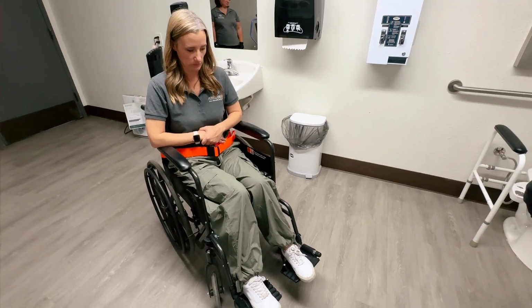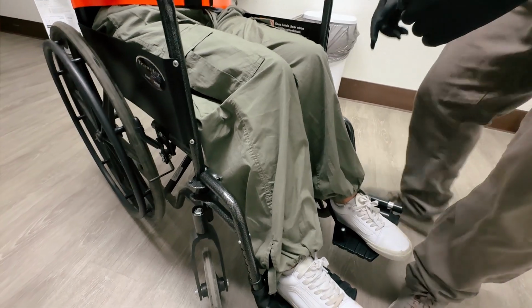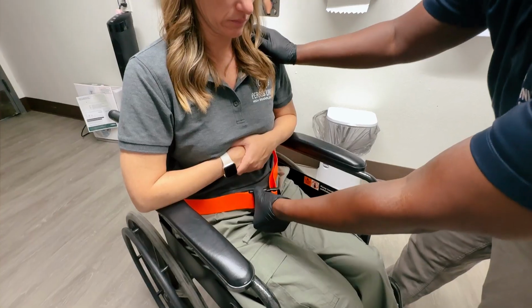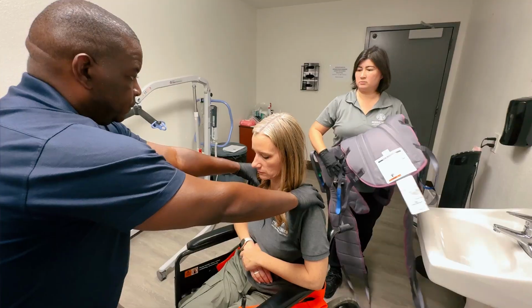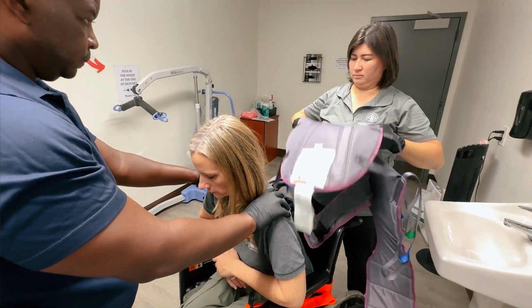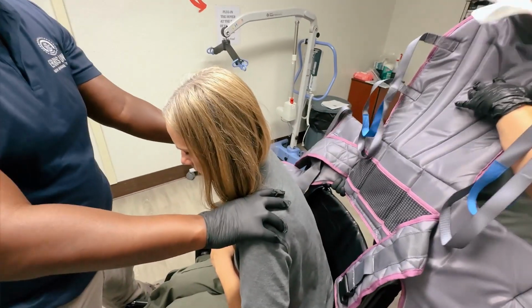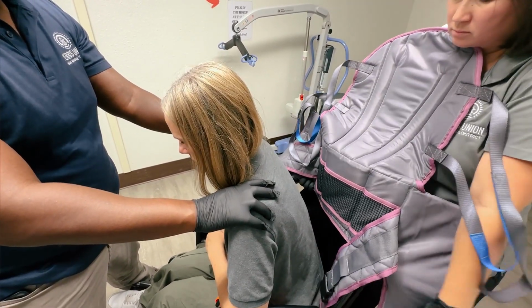Lock all wheels on the wheelchair to prevent the wheelchair from moving forward or backward. Making sure at least one assistant is supporting the student, remove the wheelchair seatbelt and other fasteners. With the student sitting in the wheelchair, one assistant in front of the wheelchair and the other assistant in the back of the wheelchair, lean the student forward. The front assistant will be supporting the weight of the student while they are leaned forward.